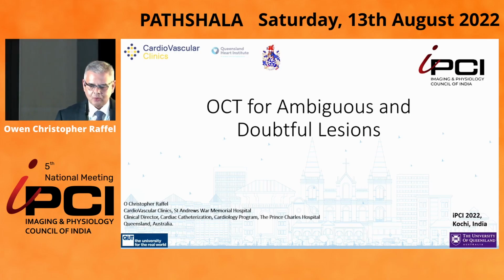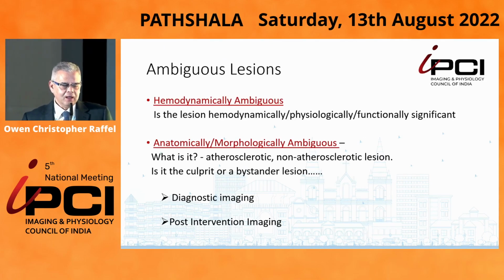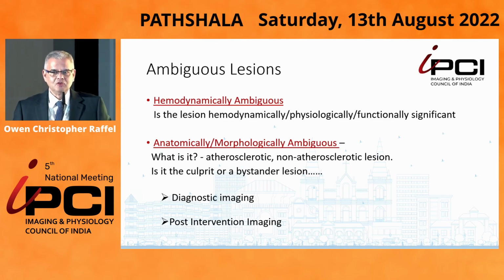Thank you, everyone. So, OCT in ambiguous and doubtful lesions. What do we mean when we say intravascular imaging and ambiguous lesions? Well, firstly, it's hemodynamically ambiguous. We see a lesion and we say, look, is this significant or not? Often we use FFR, but many of my colleagues still want to use intravascular imaging.